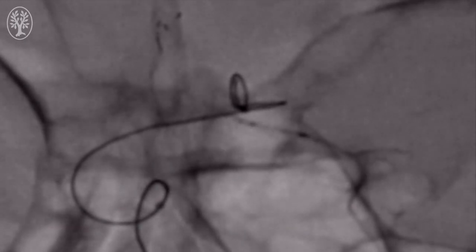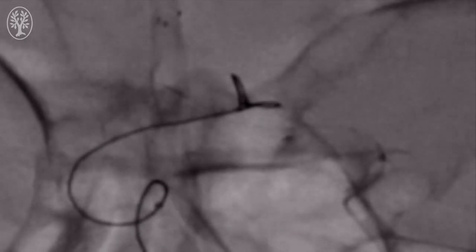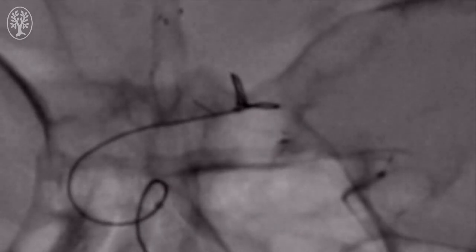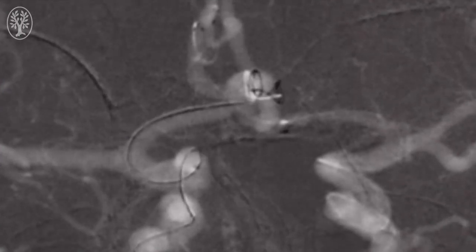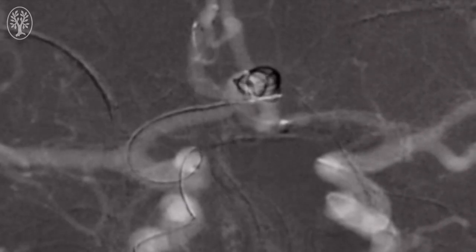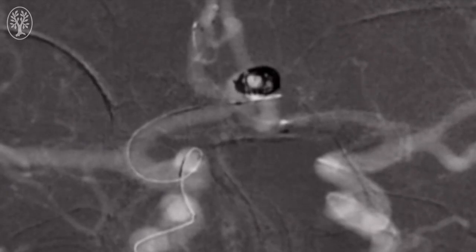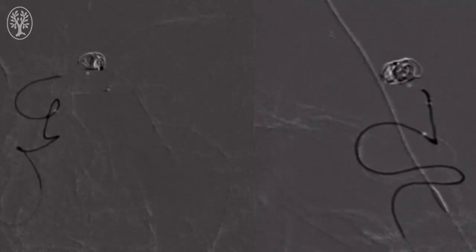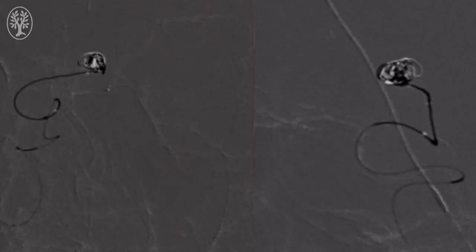Once the stent is completely deployed and we're satisfied with the positioning, we remove the contralateral microcatheter, specifically the left microcatheter, and turn our attention to the right microcatheter and begin deploying coils. As you can see, we're deploying coils liberally in the aneurysm, trying to maintain the catheter in the aneurysm, which is jailed. To clarify, we used a jailing technique where we brought the catheter into the aneurysm while the stent was in place in another microcatheter but not deployed.